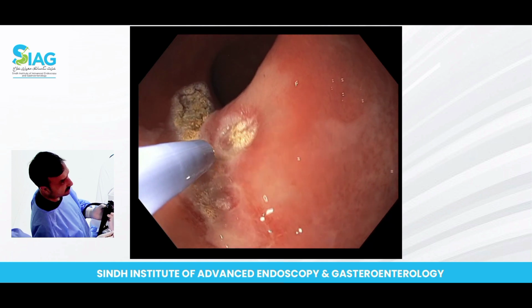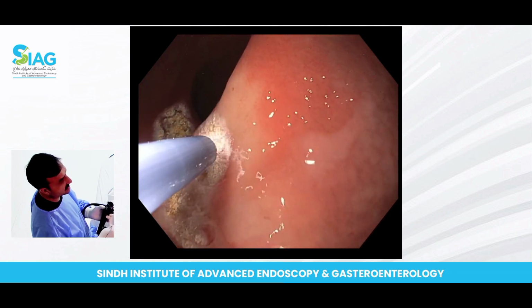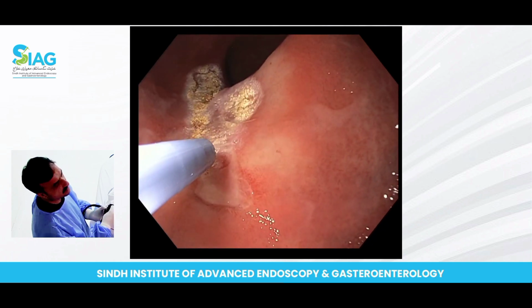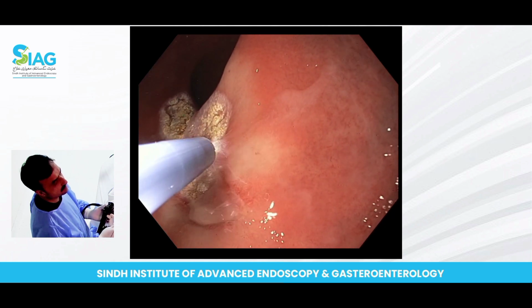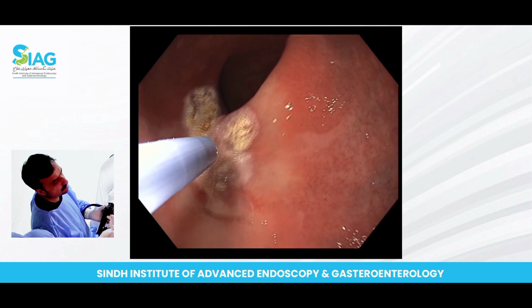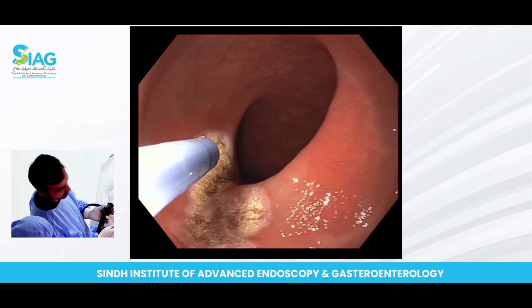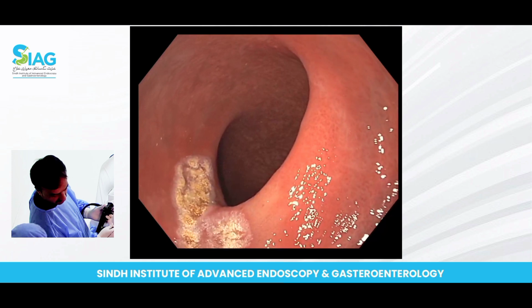When you touch the mucosal surface, there are chances that the scope opening might get blocked by the coagulation that is happening. For those students who are doing their training, they might have APC at their center, so it will be a learning curve for them as well, how we do APC for solitary rectal ulcer syndrome patients.